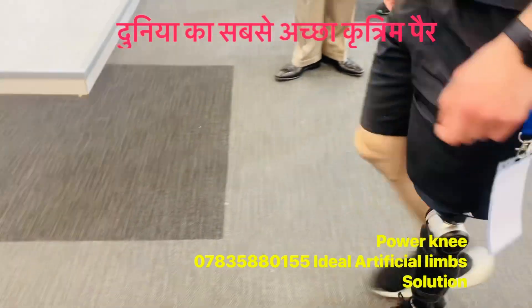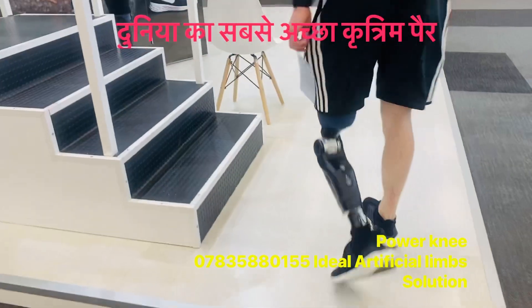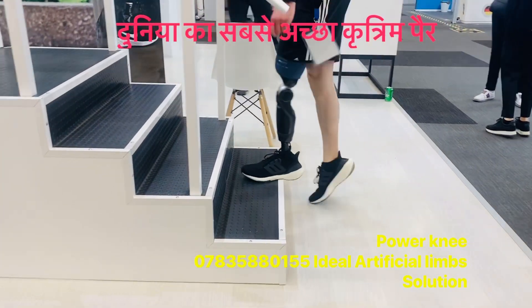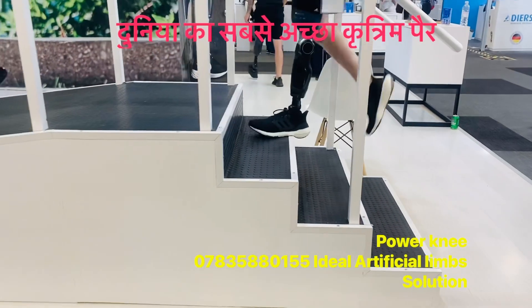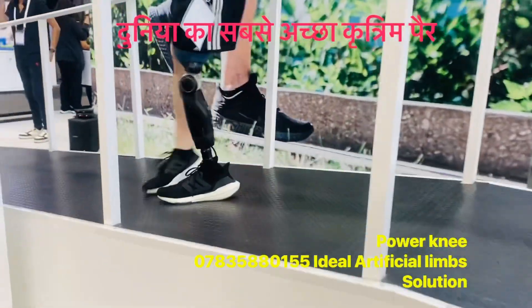Yes, can you just go over the steps — the stairs? Yes. You can see it's not like other knees. It is assisting the patient to get the down ramp as well.